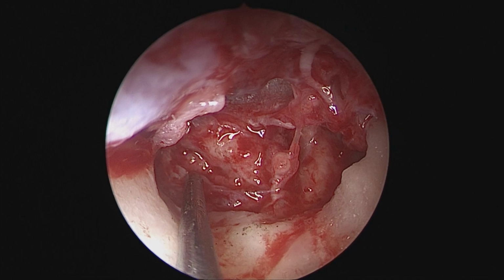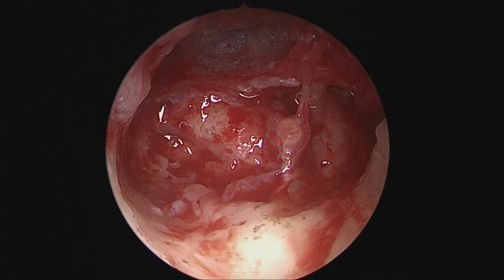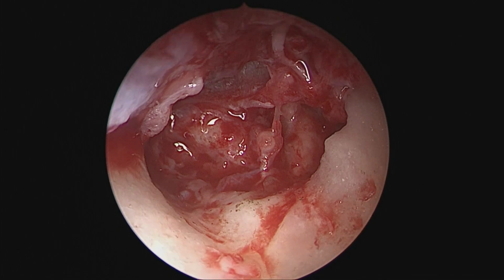Now, some excess redundant diseased mucosa from the posterior mesotympanum can also be cleared. The promontory is already seen.